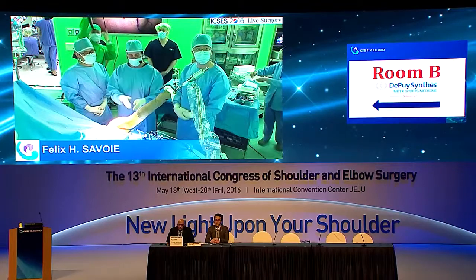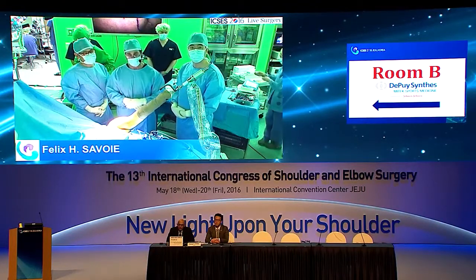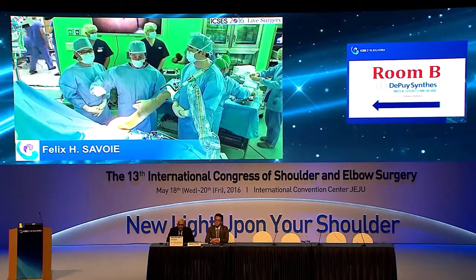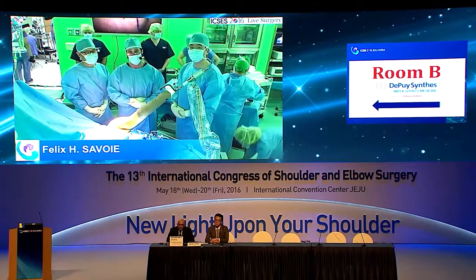We repeat the ultrasound, and if it looks better, then we start more aggressive physical therapy. But passive motion only, and we don't actually start stressing, like no active abduction, no thumb down exercises till at least 12 weeks out. What if it's torn on that ultrasound?